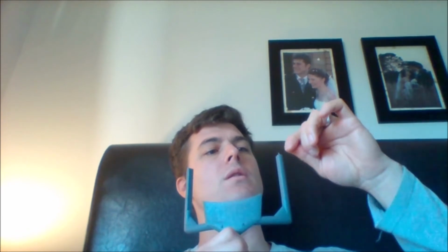Adjusting will be necessary sometimes. Not all situations are the same, but adjusting is not too hard. You just let go of the top and pull it tighter at the bottom if you want to shift it up, and obviously the reverse when you want to shift it down. The movement there is possible. It's not big though, so if you find yourself constantly getting it like that or getting it like that, you should just refer back to where your original position of your distalmost tooth was punched, and just tweak that up a little bit.